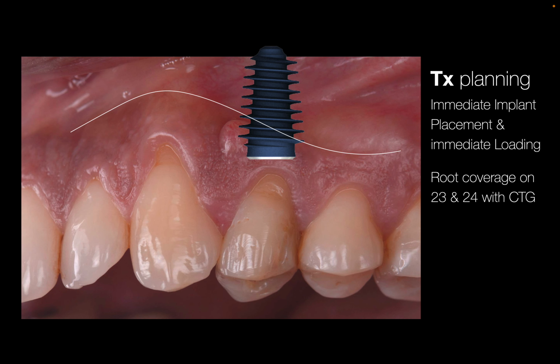So have in mind that whenever you're using a technique that is minimally invasive, that has limited access, especially visual access to the surgical site, you need to be very efficient in terms of seeing. You need to watch, you need to detect how far that bone defect goes in order to be able to regenerate and isolate as well as possible.